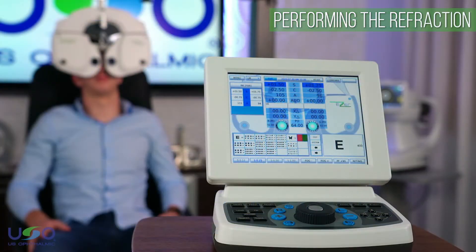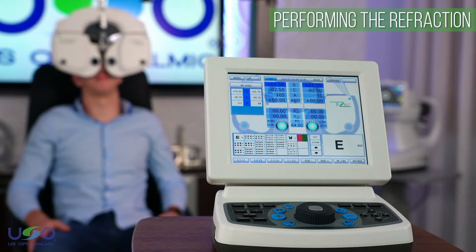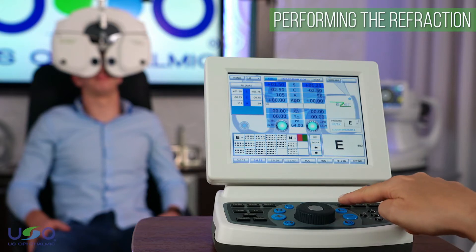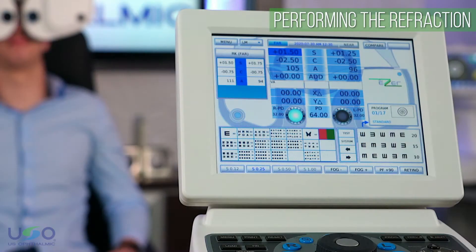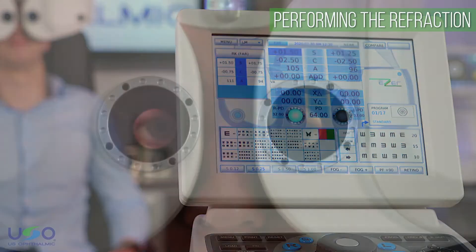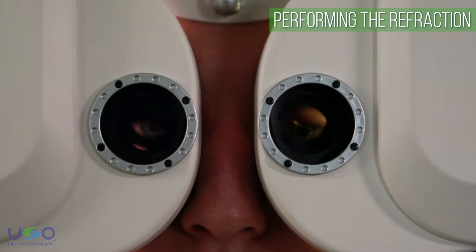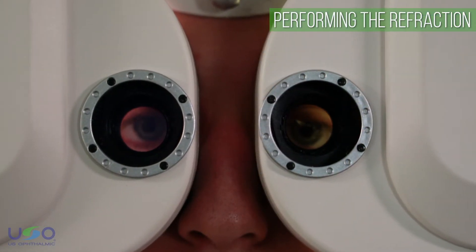Once you have all the information loaded in the digital refractor head, you can start the examination with the standard program, which can be modified according to the professional's preference. It's also possible to have different programs for different types of patients or pathologies.